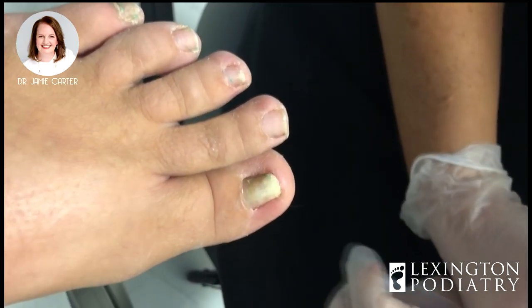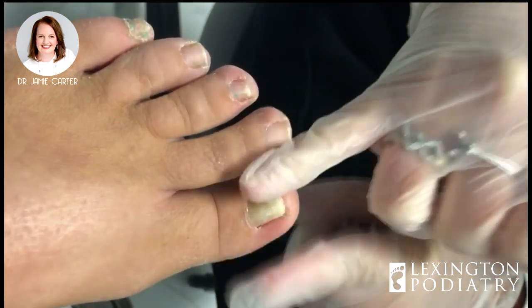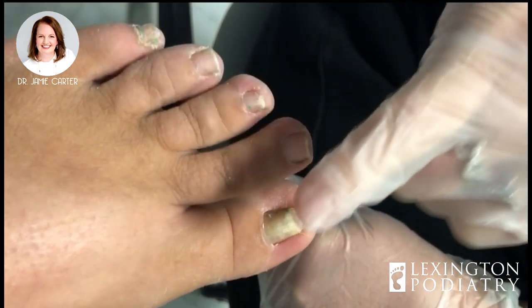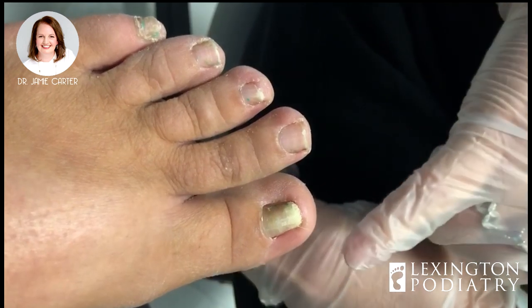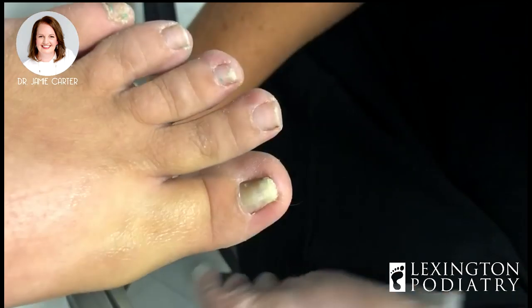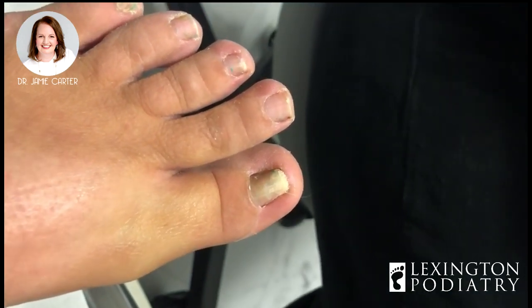Today we're going to numb this young lady's toe up. She has an ingrown toenail and has actually had the procedure done before on both sides. But today it's really this side that's bothering her. Part of her problem is that her nail is so thick that anytime a shoe or anything touches it and pushes down, it digs this side in more. So in order to prevent an infection, prevent future pain, and let her wear a closed-in shoe, we are going to remove part of that border.